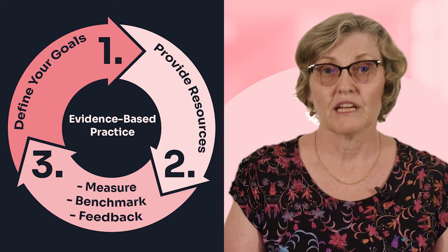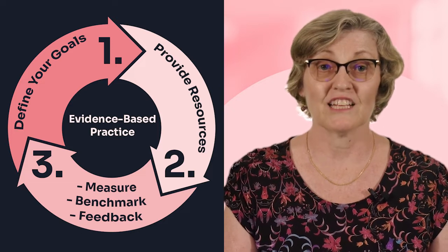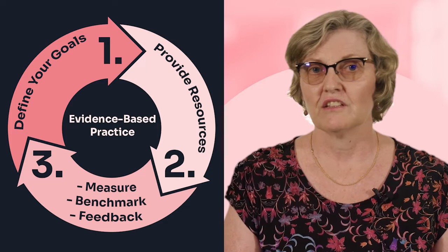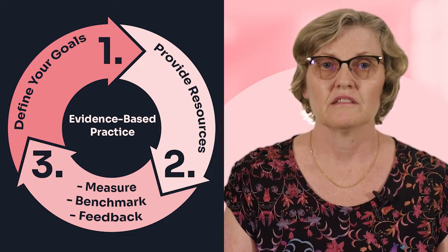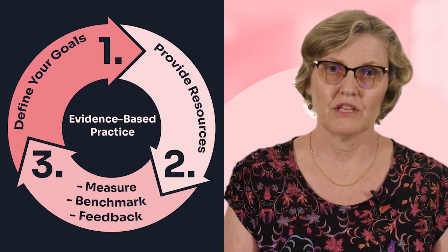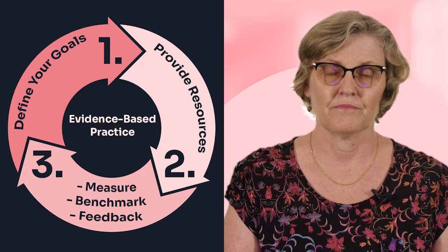So you undertake regular clinical audits of your PIVCs. Sure, it's important. Have a look at what's actually going on in your ward. You don't need to audit the whole hospital on one day. That's silly. Audit your ward. 10 cannulas a month. See what's going on. And then benchmark your findings with the literature, other hospitals, and the national standards, etc.